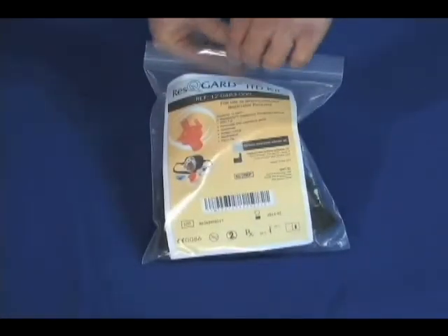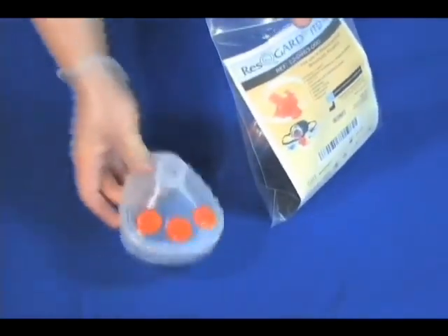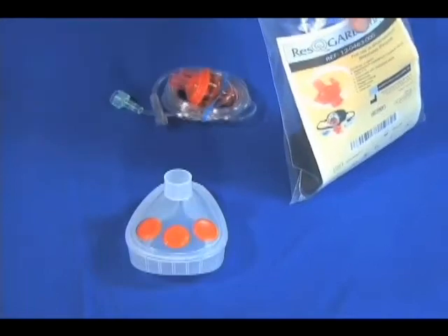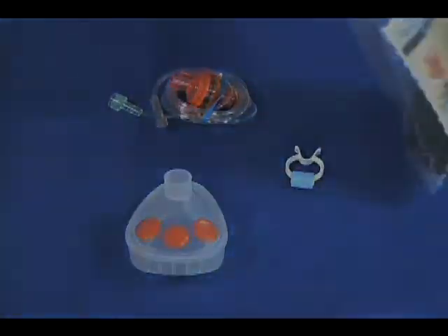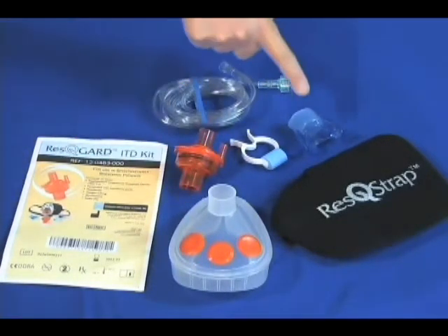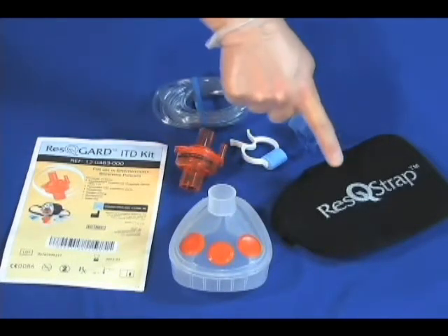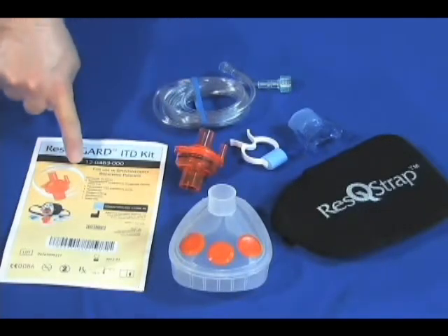Now that you have a better understanding of what a ResQguard is and how it works, let's review how to use it. To begin providing ResQguard therapy, first open the package and remove the contents. You will find a ResQguard, face mask, mouthpiece, nose clip, head strap, oxygen tubing, and directions for use.